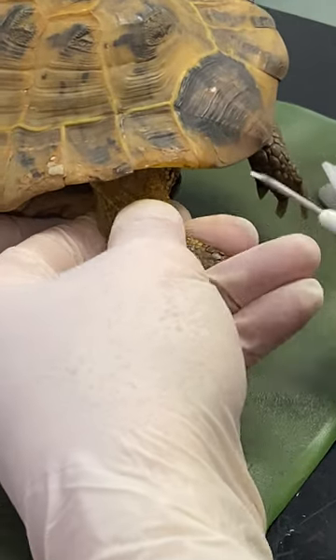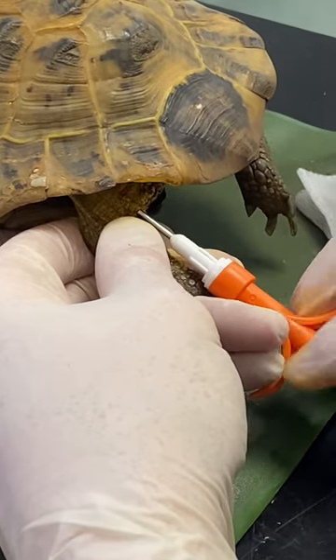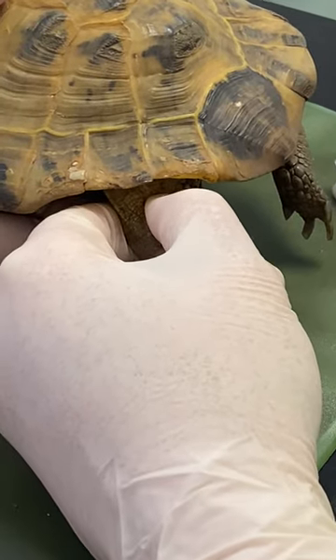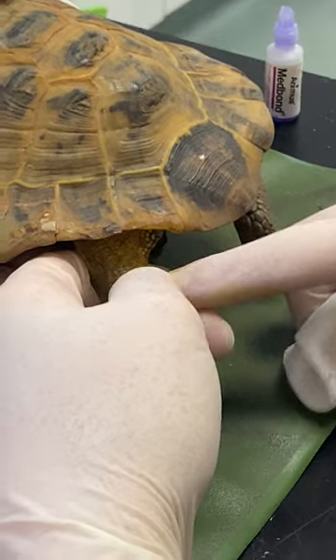We then restrain the leg, tent the skin up ever so slightly, and just insert the needle underneath the skin to pop the microchip in. Because reptiles don't really have much subcutaneous tissue, the chip can actually pop straight back out again, so we always want to apply a little bit of tissue glue onto the area.